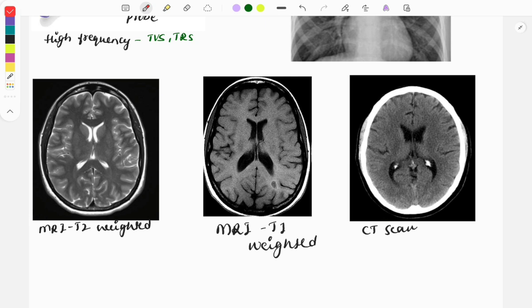Now let's discuss MRI images. How do we differentiate between MRI and CT scan? On CT scan the bone looks white, as you can see here. In MRI the bone looks black. MRI images are also either T1-weighted or T2-weighted — let's see how to identify them.